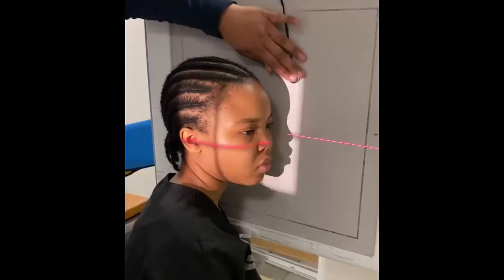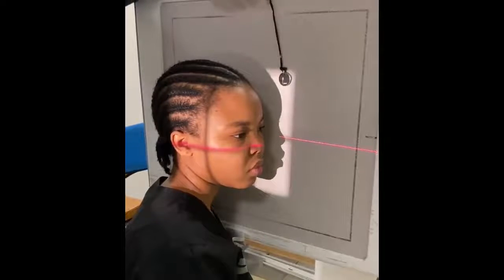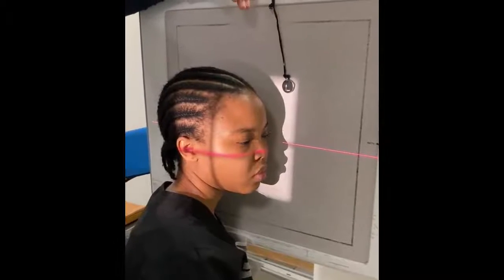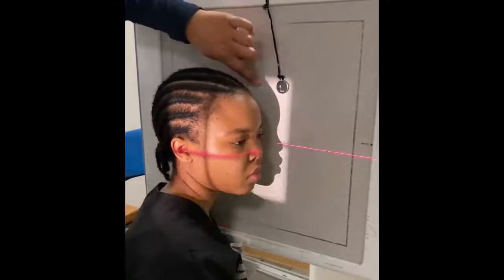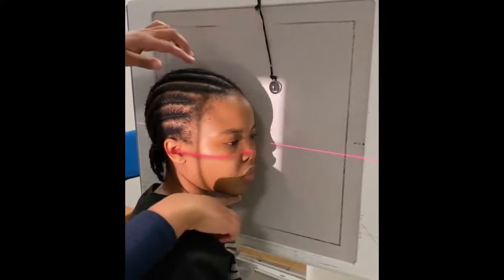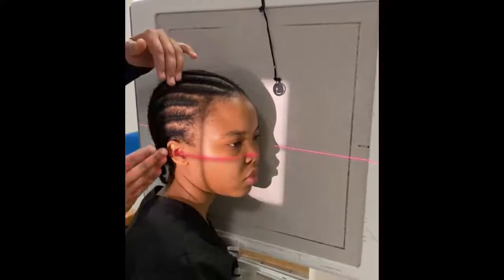Remember to place your marker. Because we're demonstrating the left side, you're going to place the left marker, and remember that you need to collimate. So it's four-sided collimation. Superiorly to inferiorly, I covered my frontal sinus area and my mandible, and anteriorly I covered the patient's nose and just slightly behind your EAM area.